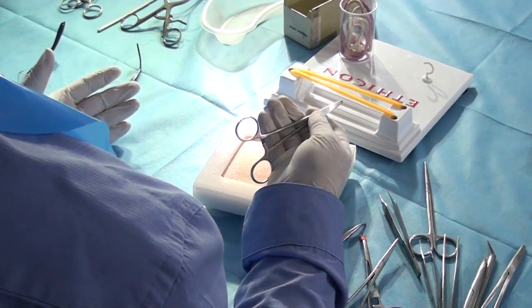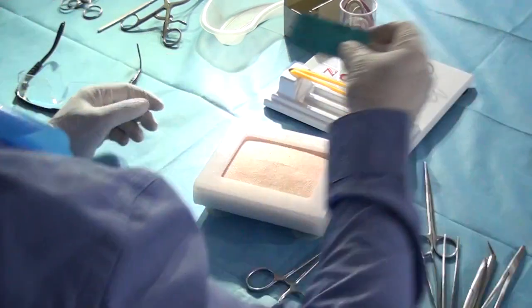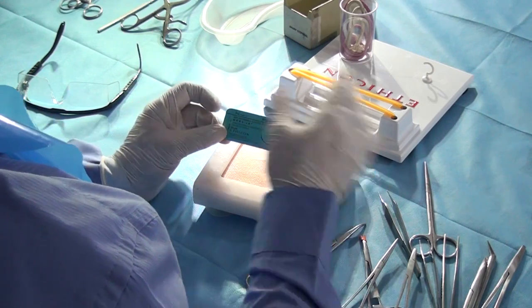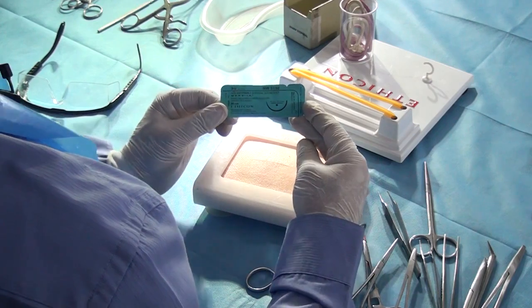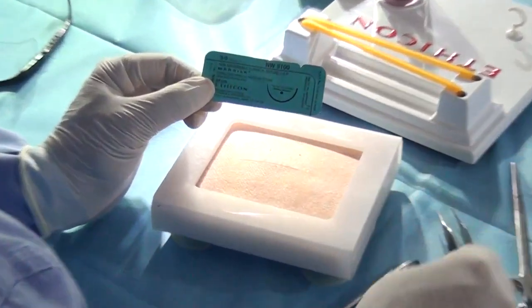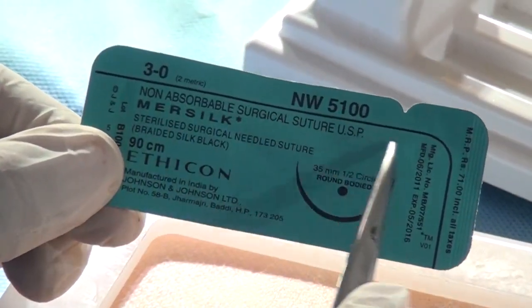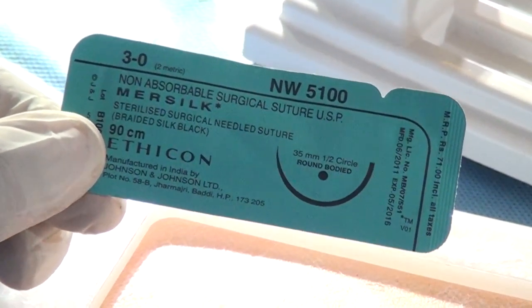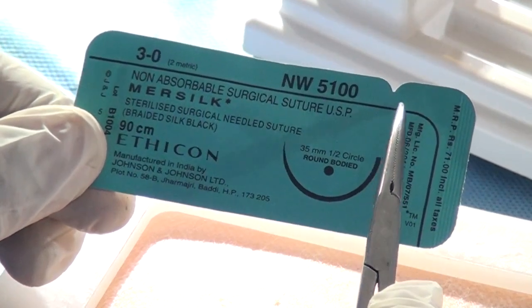Is that okay? Yes, sir. The next step is to get the suture out of the wrapper. And this is an important step before I allow you to make an incision and a suture, because by now they would have settled down. Please look at this wrapper of a suture. There is a line here. If you cannot see, please tell me. You can see. Yes. And there is a slit here. Learn to say yes and no, please. Yes, sir. Now, this slit is where I have to tear it.